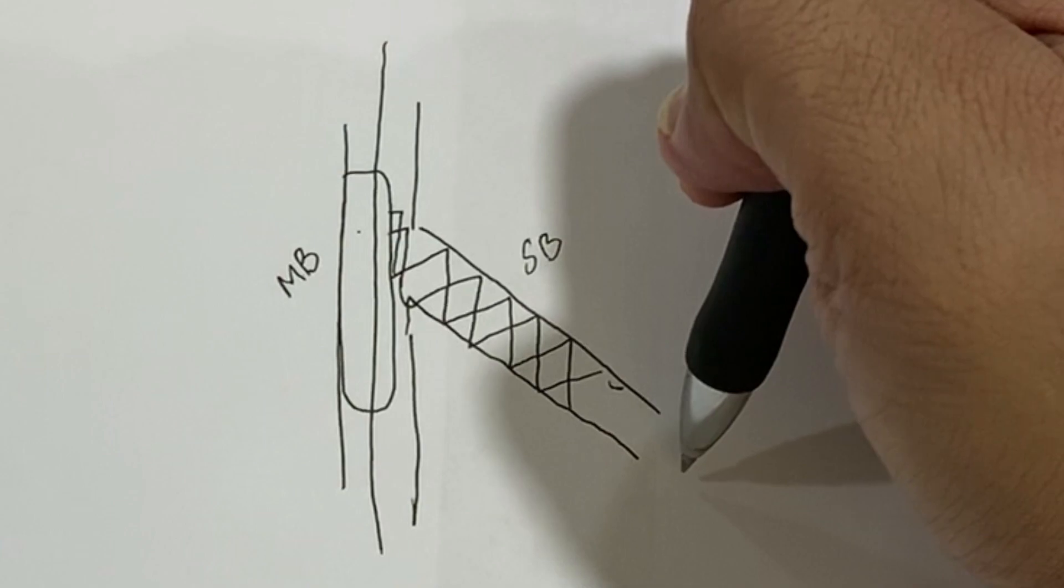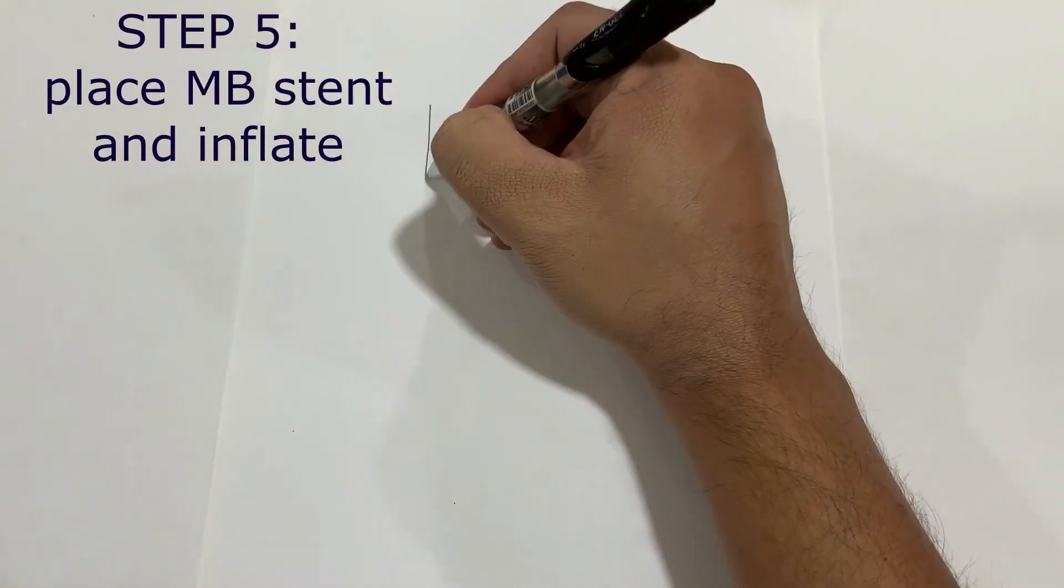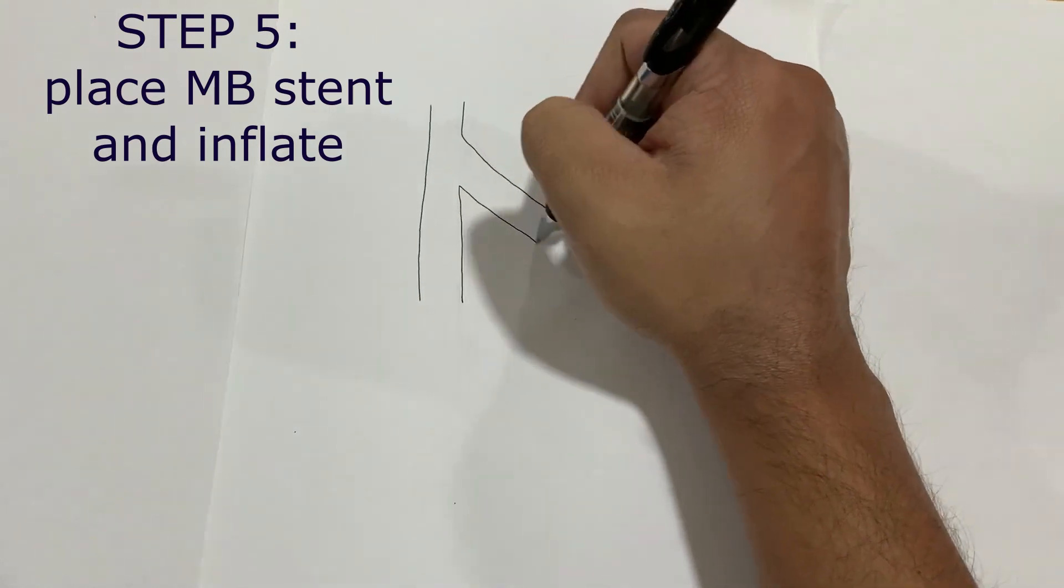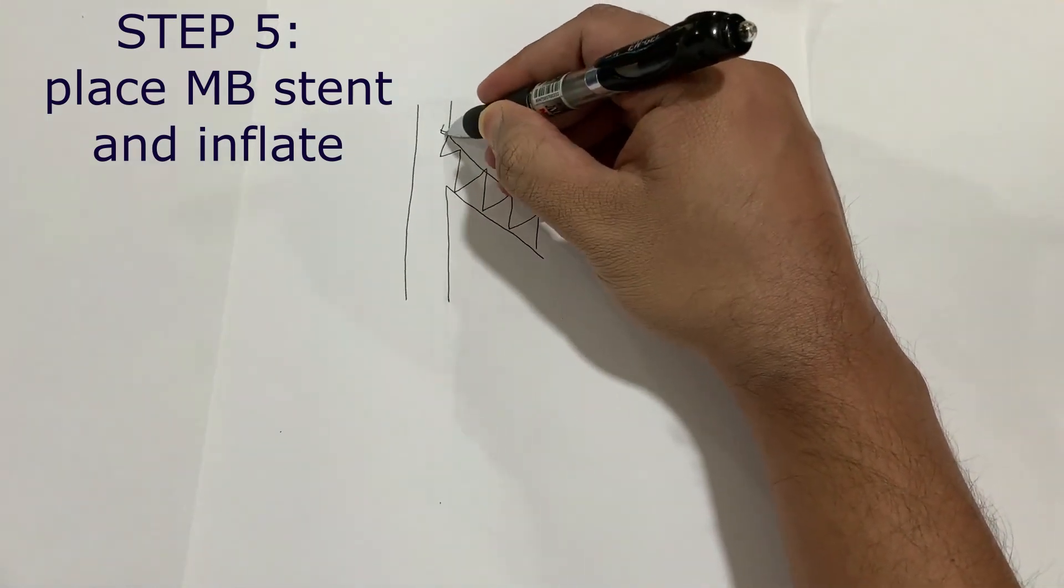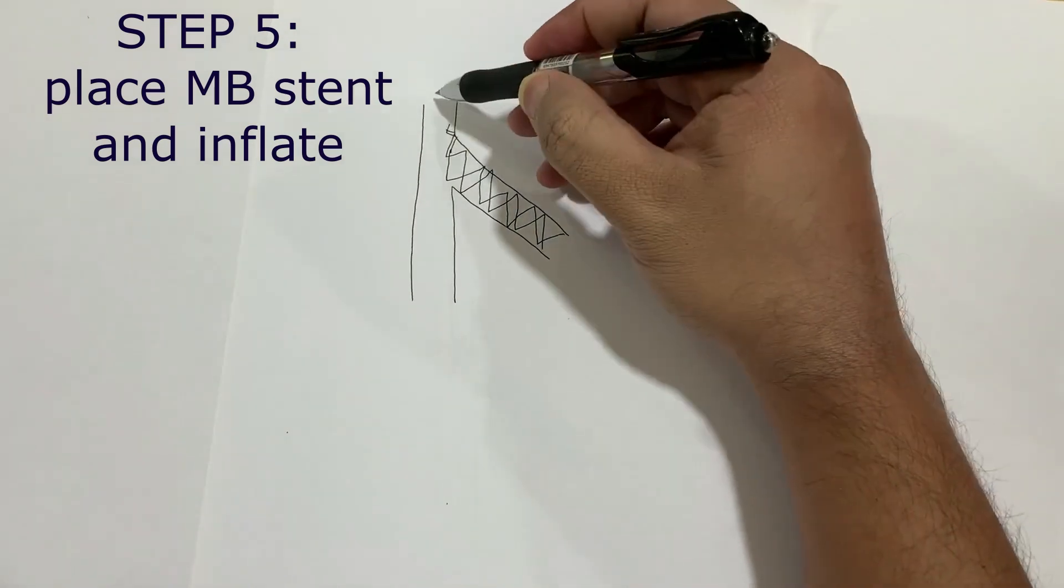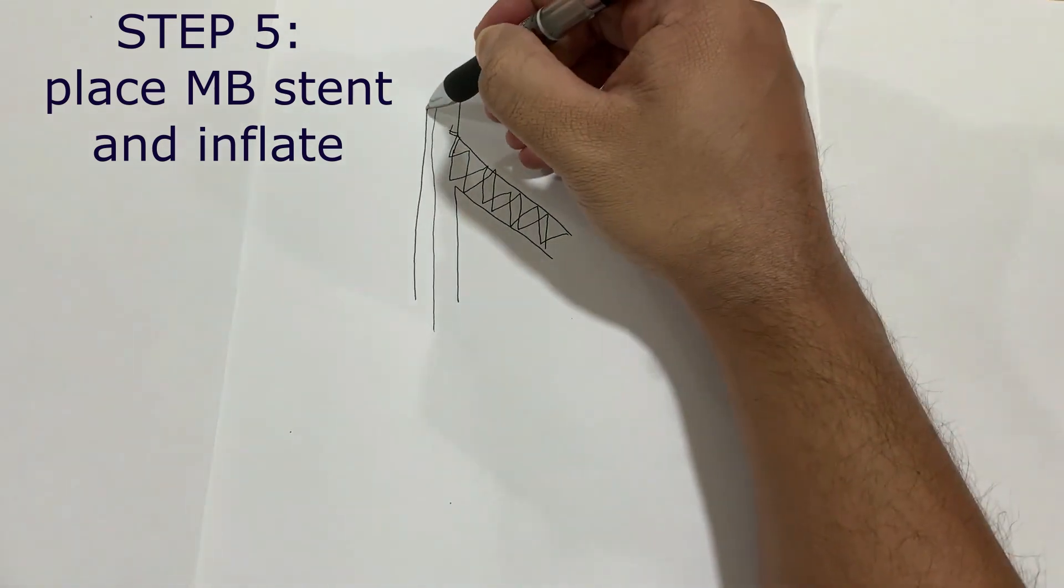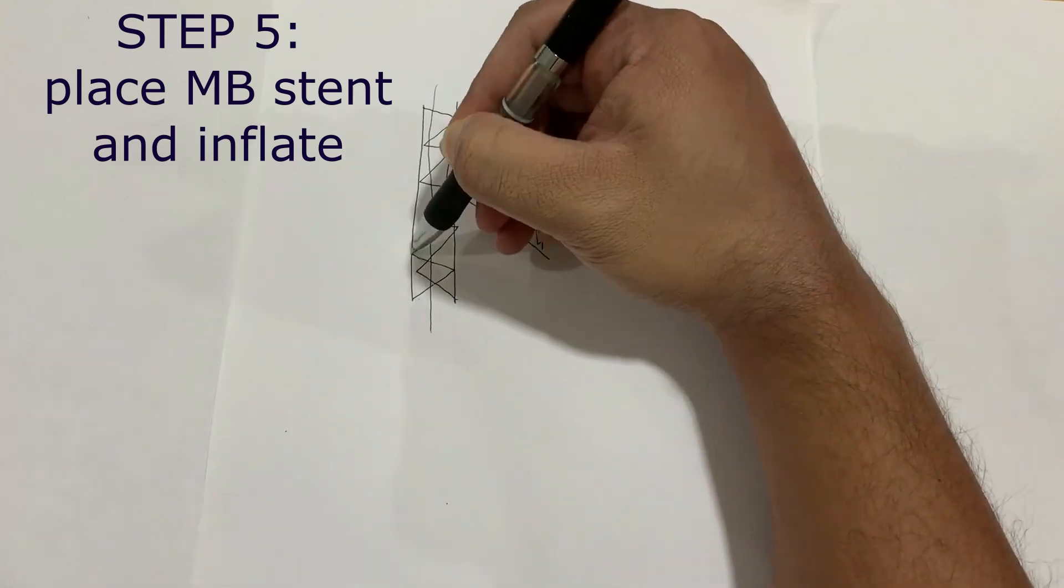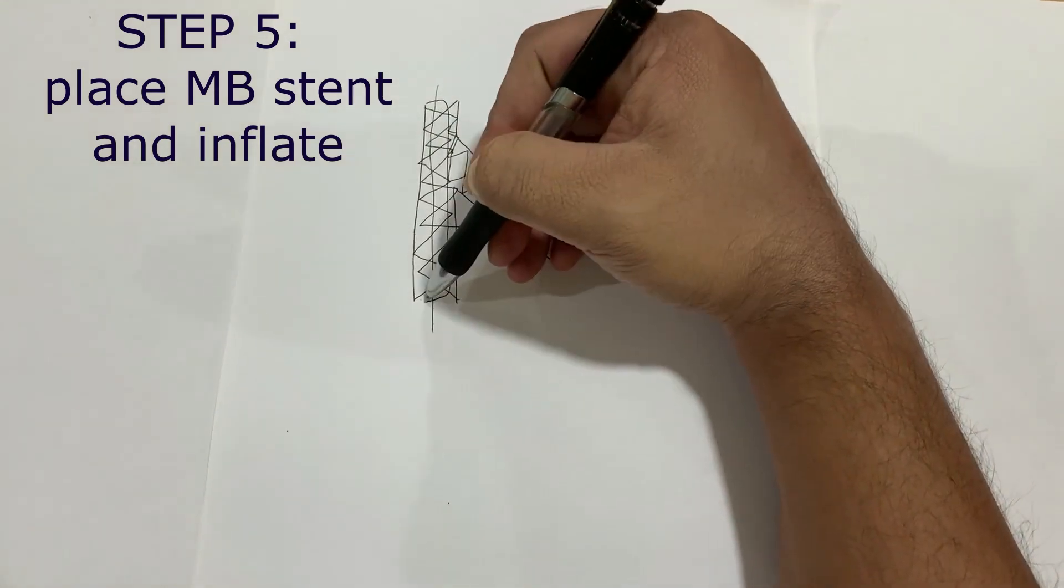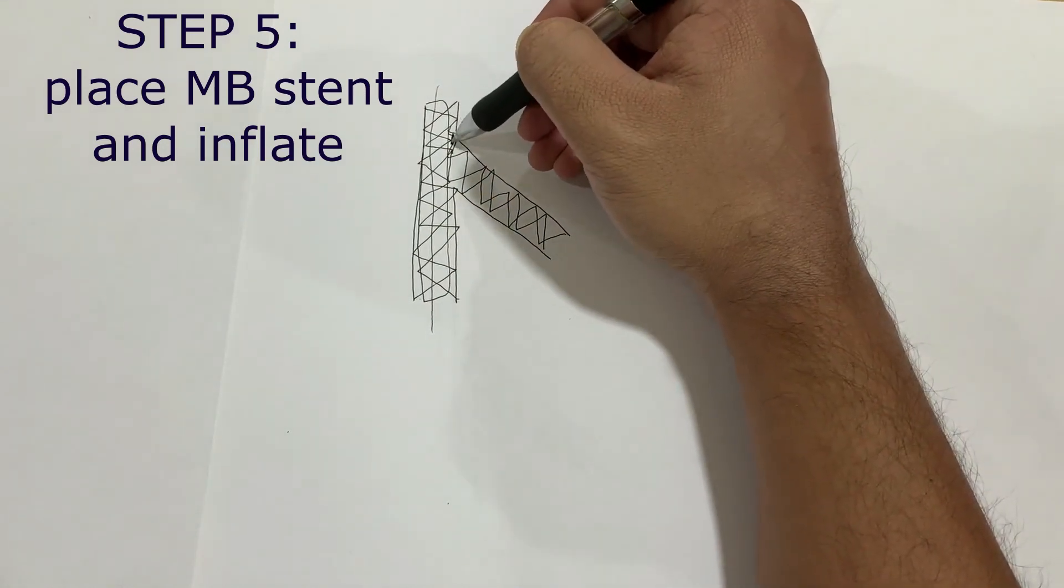Then after crushing the side branch, bring the stent on the main branch and inflate this stent.